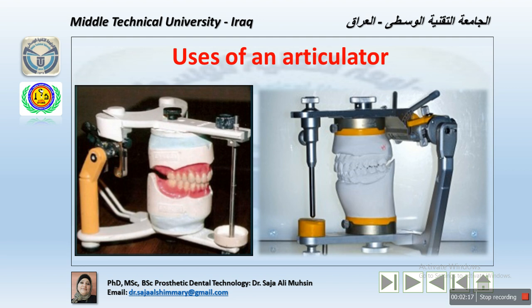Also, the articulator is used to plan dental procedures based on the relationship between opposing natural and or artificial teeth. That means if we have a partial denture opposing a complete denture, or opposing natural teeth, or opposing another restoration like an implant or fixed prosthesis, the plan of procedure will be more clear in terms of identifying these within a device like the articulator.